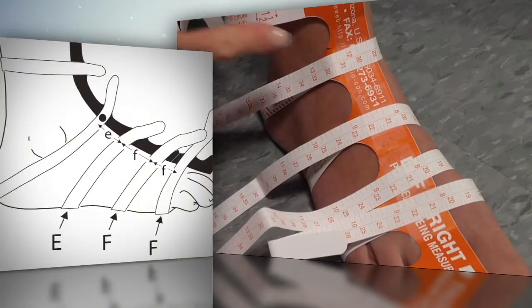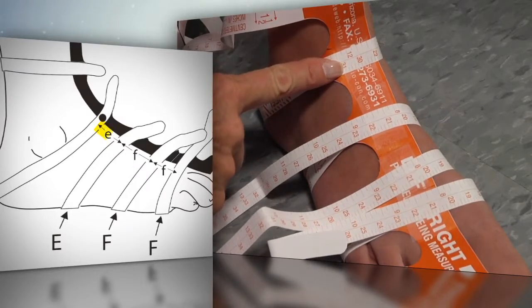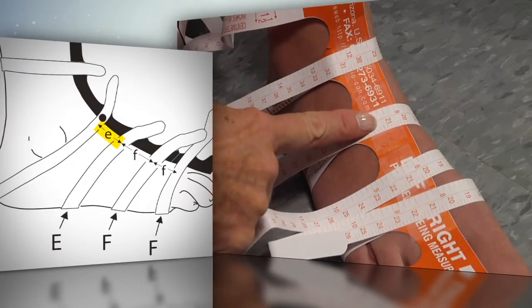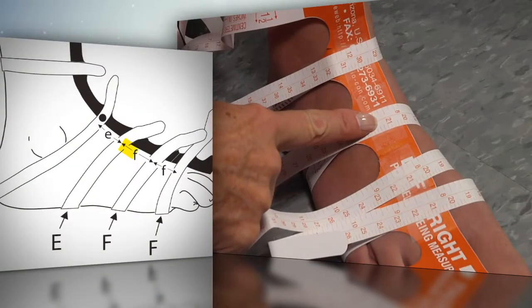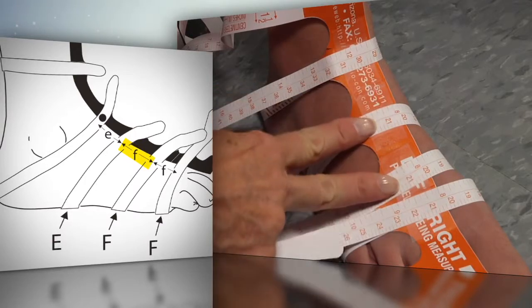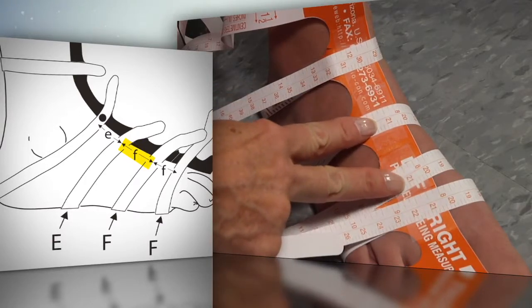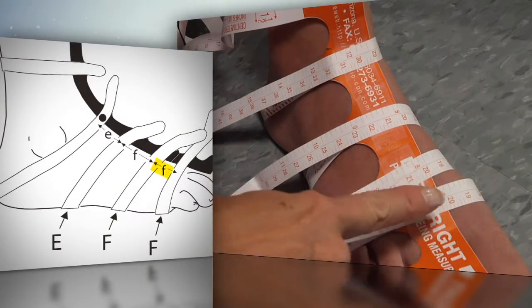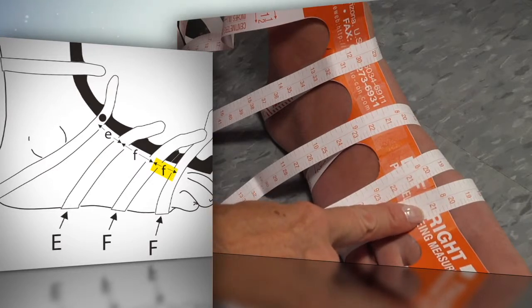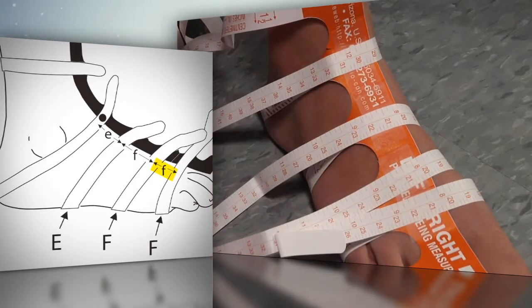The little e measurement is the distance between the circumference of the heel, the capital D measurement, and the capital E measurement. The first little f measurement is the distance between the circumference capital E measurement and the first circumference capital F measurement. The second little f measurement is the distance between the first circumference capital F measurement and the second circumference F measurement, which is the circumference of the base of the toes.